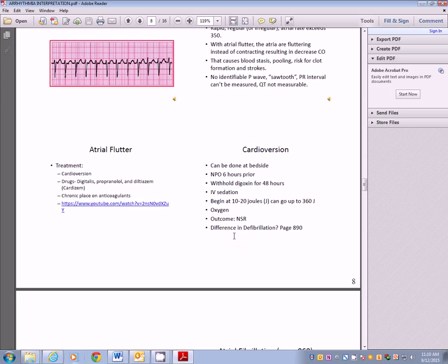For cardioversion, the defibrillator must be set in a synchronized mode, whereas defib is in asynchronized mode. For cardioversion, make sure the monitor leads are attached. Do not charge the defibrillator until ready to shock, and keep your fingers off the discharge buttons until you're ready to. Exert enough pressure on the pads to ensure adequate contact prior to discharging the volt. Call everyone to clear the area prior to discharging. Document the procedure and the effectiveness, and inspect the skin for burns.